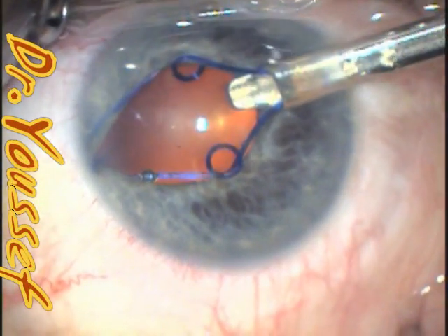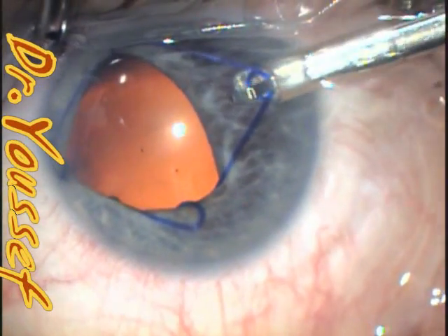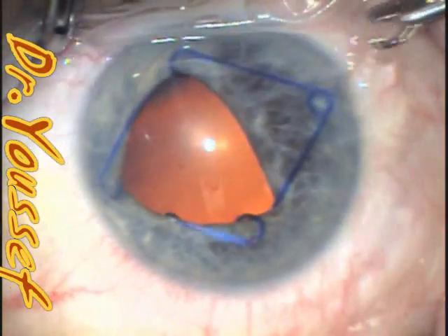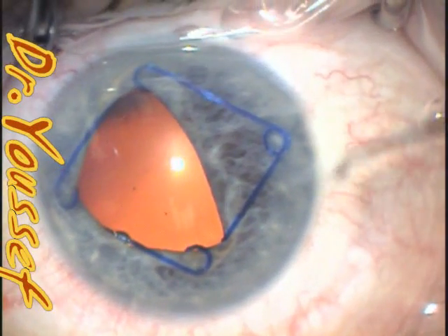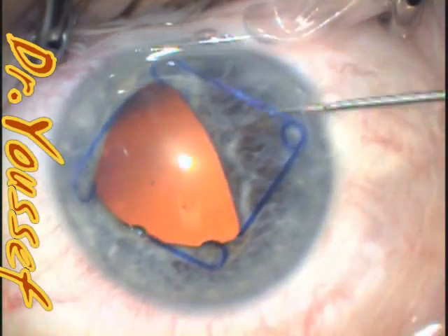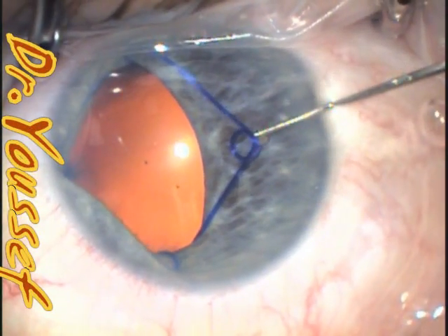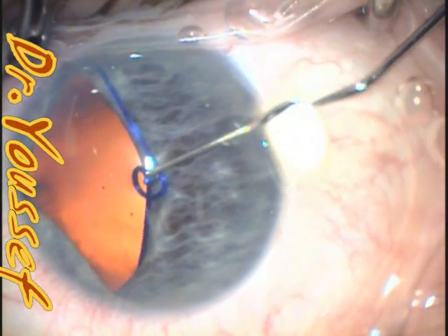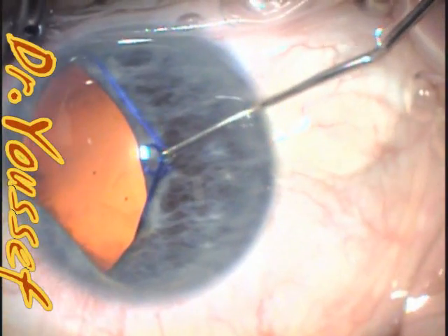I usually do the superior one first — the one on my right — and then the inferior one on the left. As I'm going down outwards, I rotate actually 90 degrees to one side so that the hook disengages the temporal ring, and then I reposition the temporal ring using a mushroom or button tool, or now I use more of the MacPherson as it's more controlled. I just hold the anterior part of the ring and adjust to engage the temporal part of the pupil.